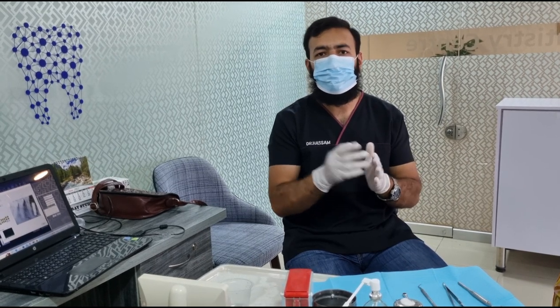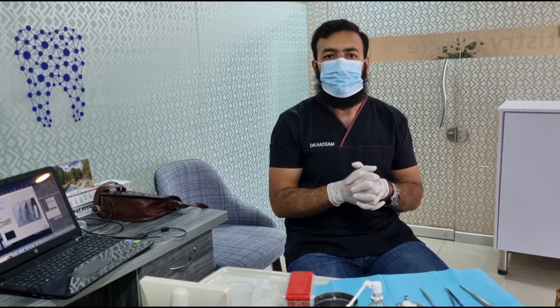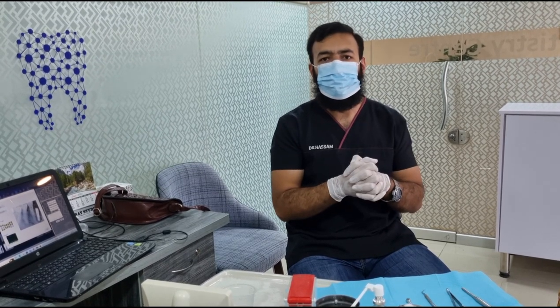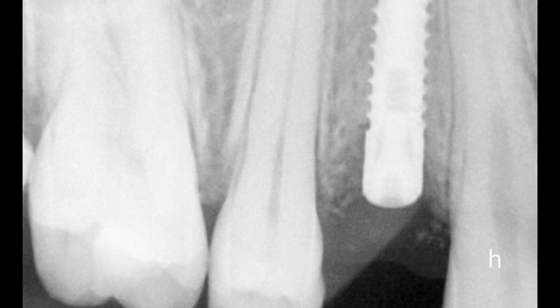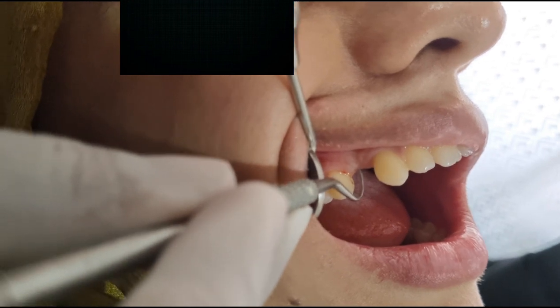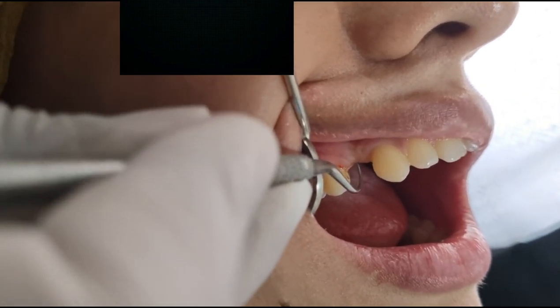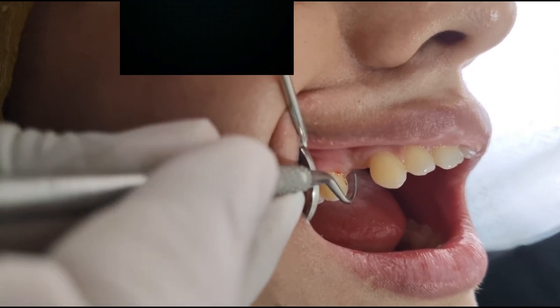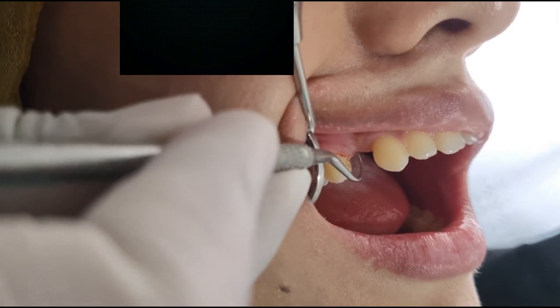Once you have found the exact location, insert the probe, mark the area, and then remove the soft tissue above it to gain access to the implant. Here I am inserting the probe into the soft tissue area and I am already feeling the implant in this location — by slight movement I can feel the metal-to-metal contact in the probe.